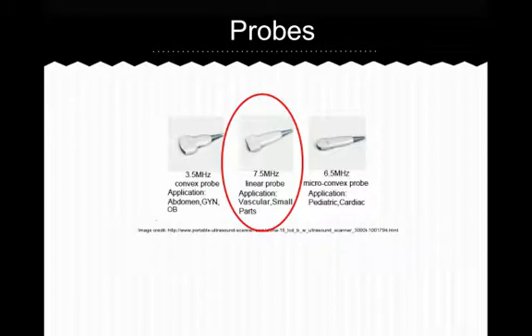The low-frequency curvilinear abdominal probe has a larger footprint, or portion that contacts the body. This probe has a wide field of view and a low frequency that is good for deep structures like the abdomen. It's often used for the FAST exam to detect blood or fluid in the abdomen after trauma.